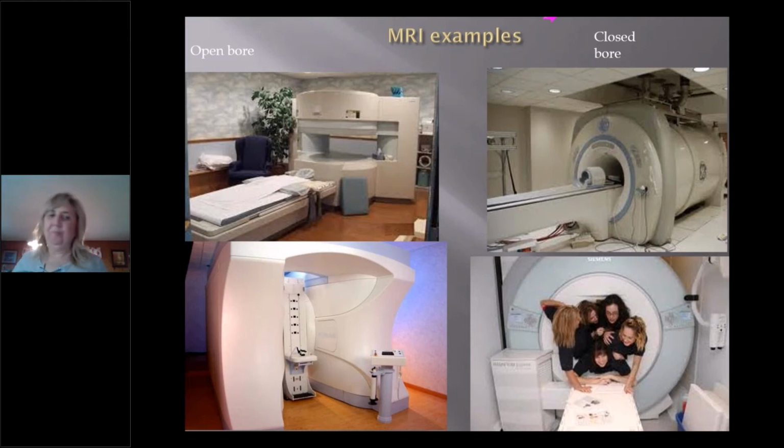So here's a couple of different examples of MRI magnets. The far right magnet's really the most archaic one, the tight, small, closed bore magnets. The upshot to those is they really gave you good pictures. The downside is if you look at that hole, only about 10% of Missourians will fit in this thing without grease and a shoehorn. If we look at the open bore, we jokingly call these hockey pucks.